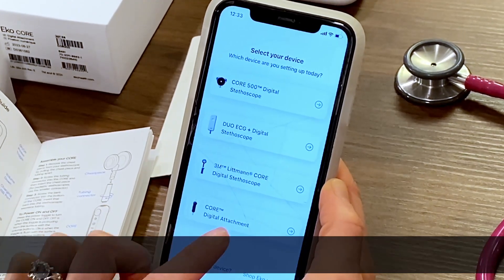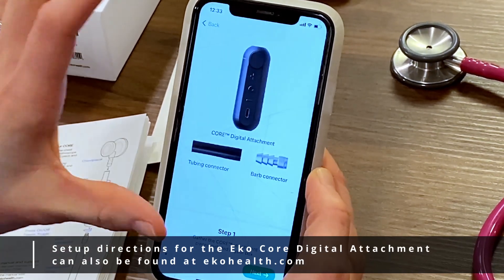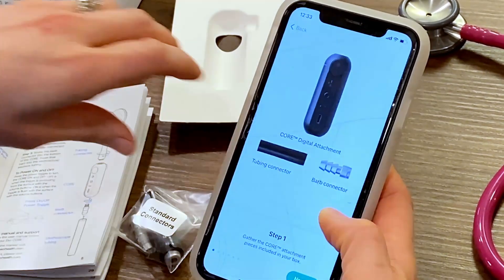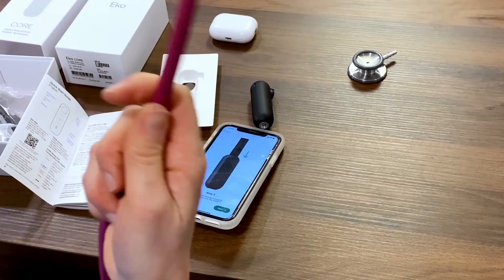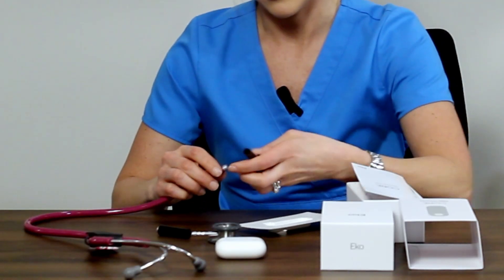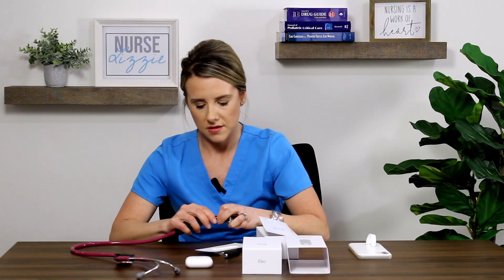Let's go ahead and set this up. We're going to pick the Core digital attachment — that's what we're working with today. I like that the directions are right there, very visual. So we need our digital attachment, the tubing connector, and the barb connector. I'm going to take my chest piece apart from the tubing. I disconnected my chest piece from the tubing and I'm going to put the tubing connector in place. You get a barb connector — it's just a simple metal grommet that you stick inside your stethoscope tubing, and that attaches to the Echo digital attachment. Then I put my bell back on.